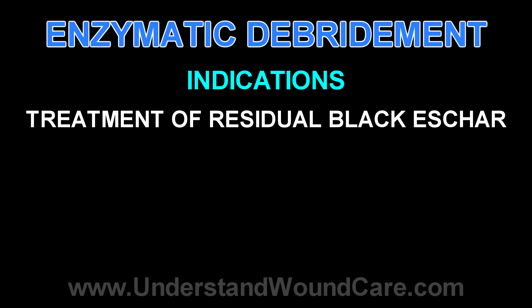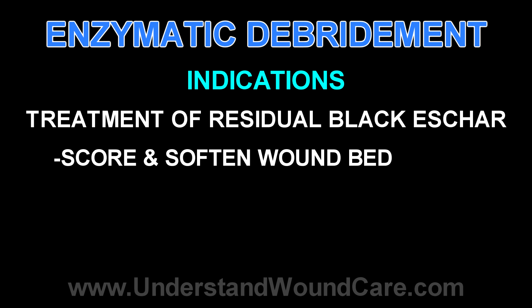The second reason post-debridement is that you might have some residual black necrosis, which we mentioned earlier, which you can score, increase the surface area, and allow the collagenase to soften it for the next time.